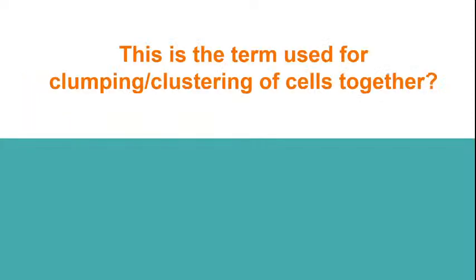All right. Now, another abnormality in terms of cellular distribution is something that is called clumping or clustering of cells. Now, in clinical microscopy, particularly when we're viewing urine and semen samples, we just call them clumping or clustering. All right, there's clumps, so we would often note there are clumps of WBCs present in the patient's urine sample. There is agglutination. This is what we call agglutination when we look at it in the semen sample. Similar to that, RBCs have the same thing.